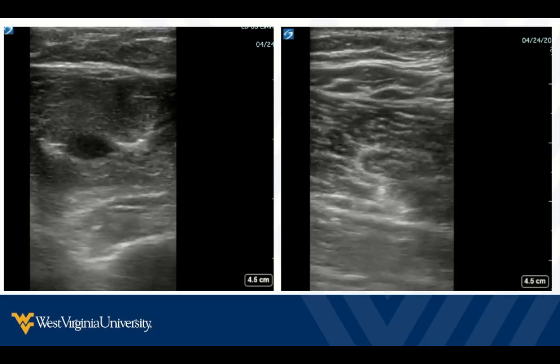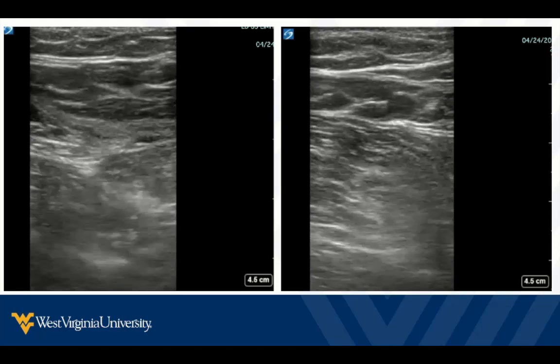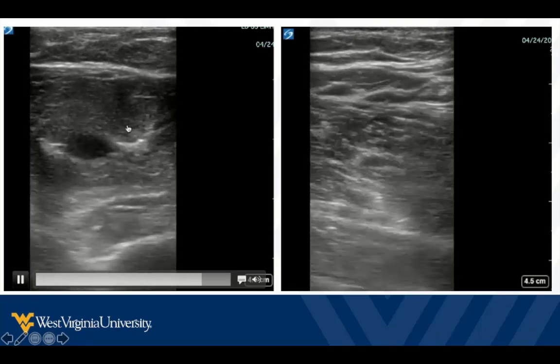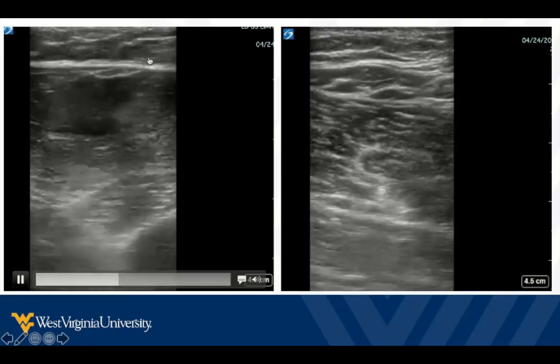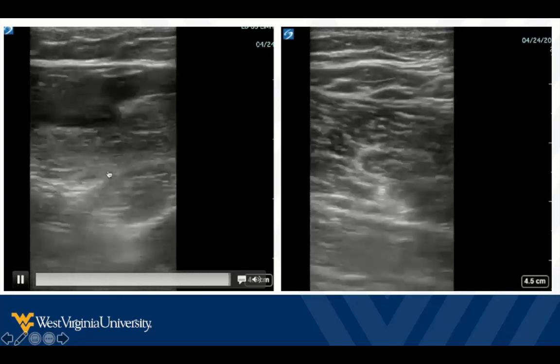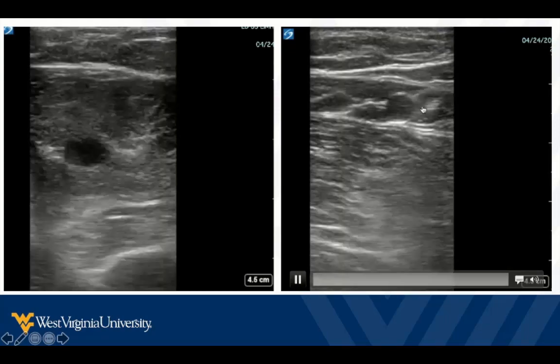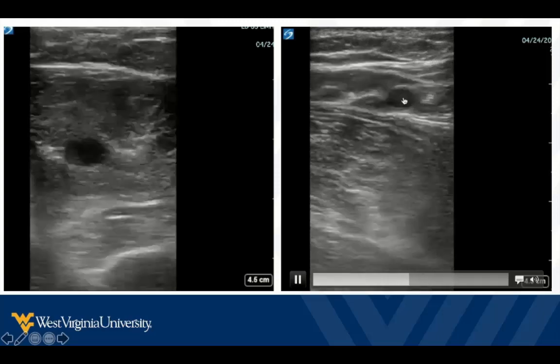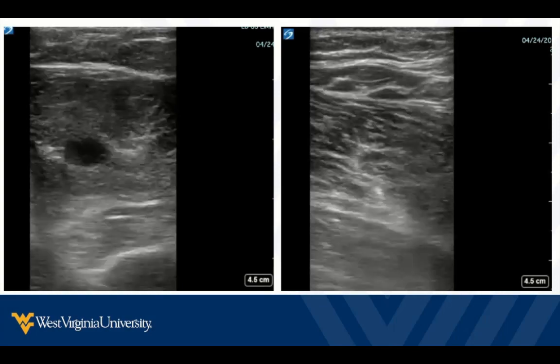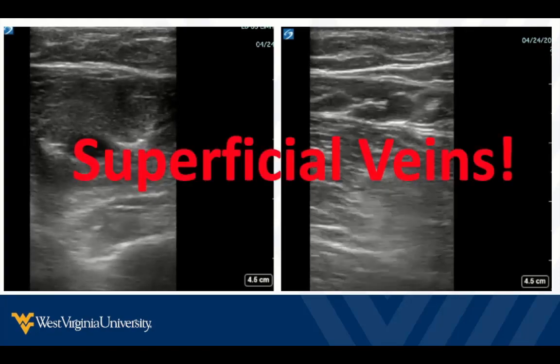A few mistakes to avoid. The most common are not identifying the arteries and focusing on superficial veins instead of deep veins. In these cases, we find a vein that collapses but we don't see any artery associated with it, and it's all just in the superficial subcutaneous tissue — only about one and a half or two centimeters deep. That's a clue we're not looking at the correct vein. These are superficial veins, not the veins of interest. There may be a deep venous clot down deeper that we're missing. Go deep enough, find the arteries, and when you compress you should see bone at the bottom of your screen.